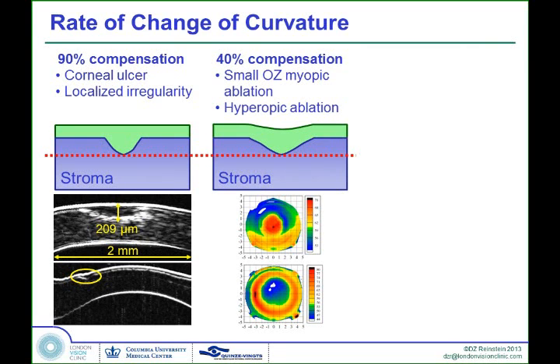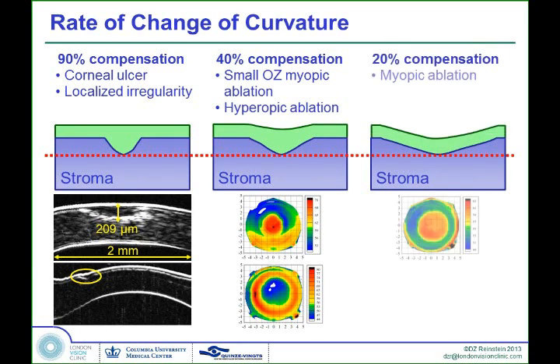And of course, as David O'Brart proved scientifically in the 90s, if you take an optical zone of 4.5, 5, 5.5, and 6 millimeter and compare the regression rates as you increase the optical zone, you get less regression. And that was published in the mid-90s. Very elegantly, this was done. So as you know, when we use larger optical zones, there's less regression.